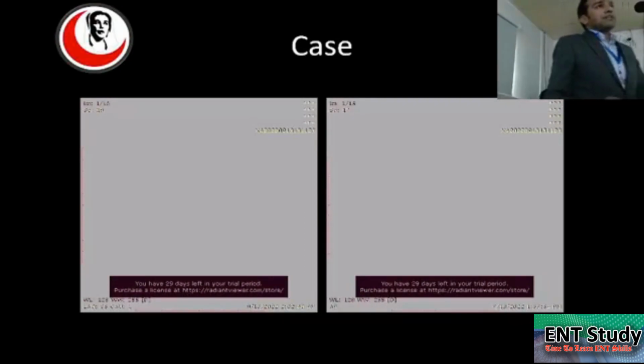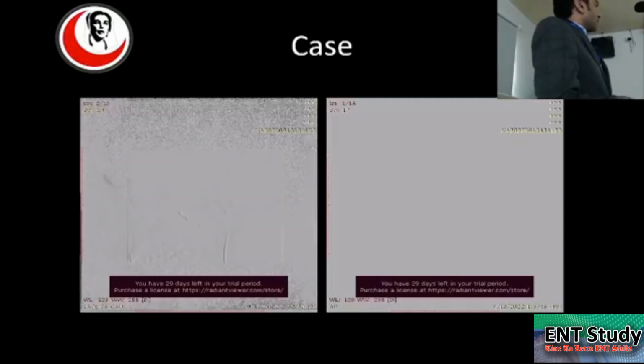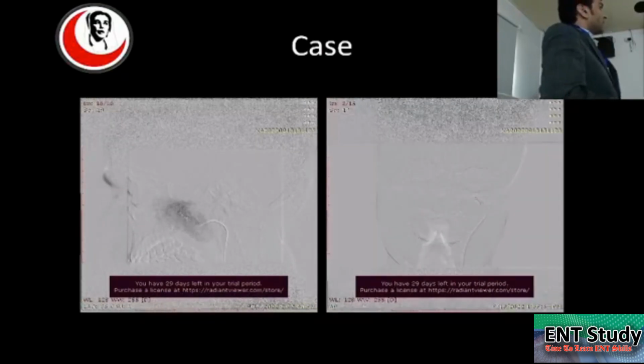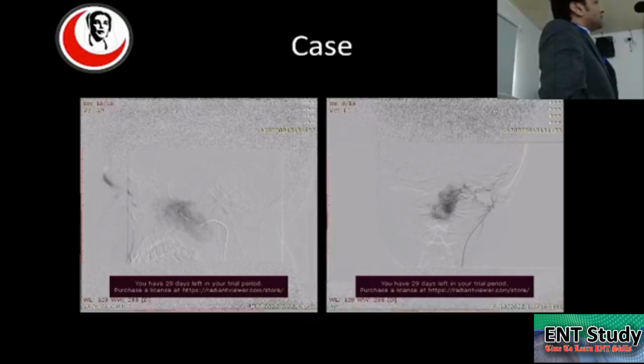I have done many cases of pre-surgical embolization in the trauma center. These are a few of them. Here the internal maxillary artery was selectively cannulated and a large blush was identified. This is the AP view of the same patient showing a large blush.